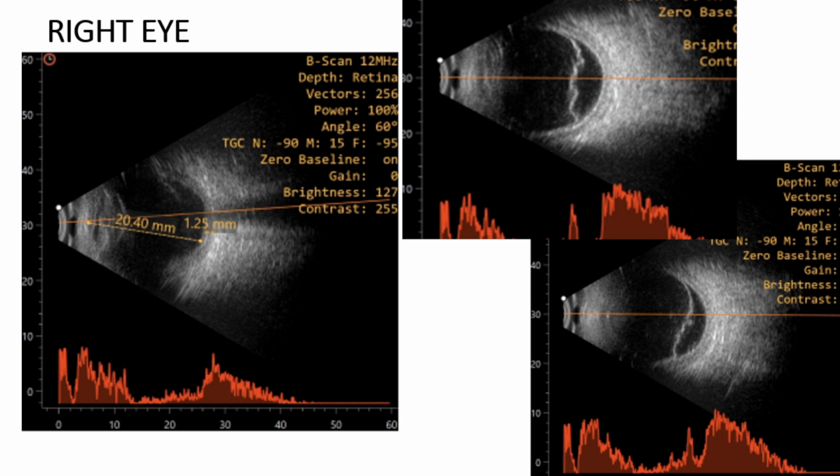What else can you make out on the axial scan? Something which is also seen in the other scans also. Thickened choroid. And do you want to give any other information regarding the two images on the right side? Yes, ma'am. The first image was taken in supine position.